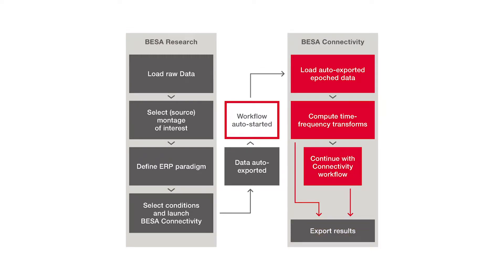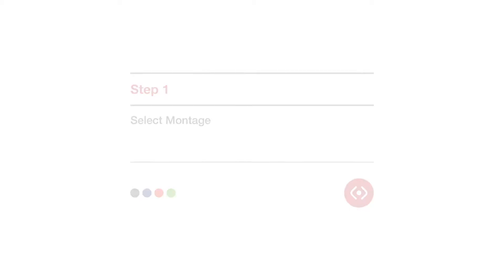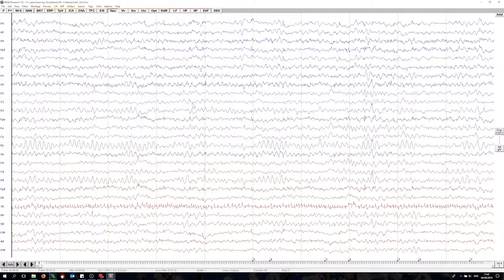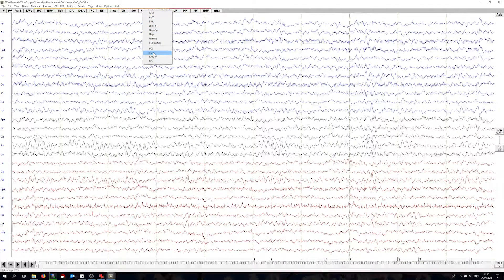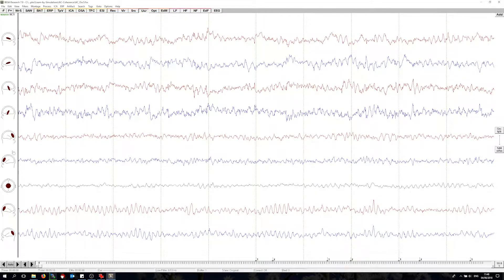Now let's see how that works in the real world. Here I have my data which is a resting state recording where some auditory oscillatory activation simulation was superimposed as a simulation. Let us first transform this data into source space using a user-defined source montage. This nine-channel montage has four auditory sources that cover our simulated activity and five additional sources that model non-stimulus related background brain activity.